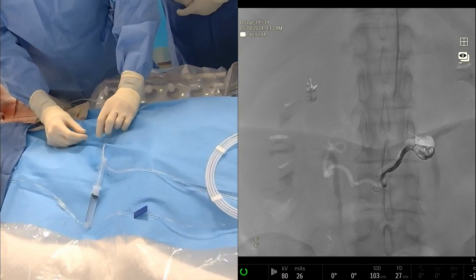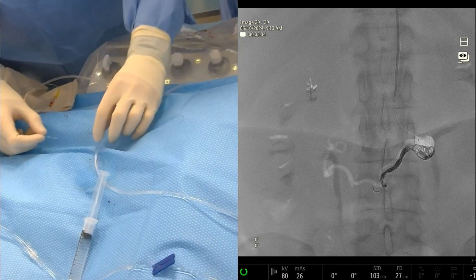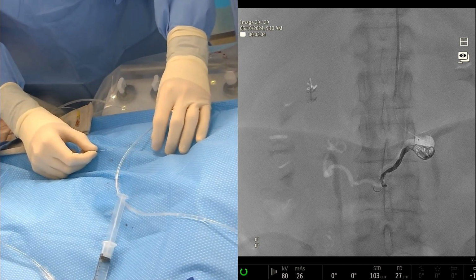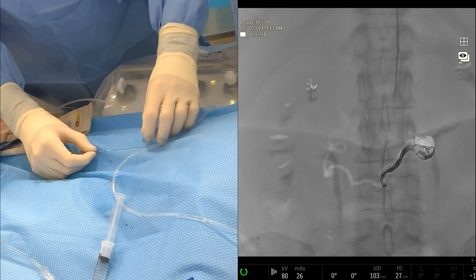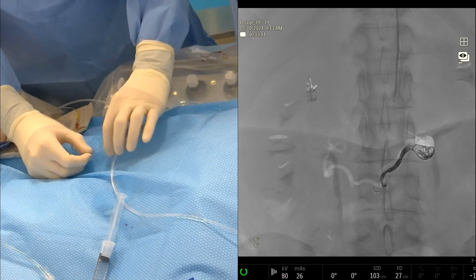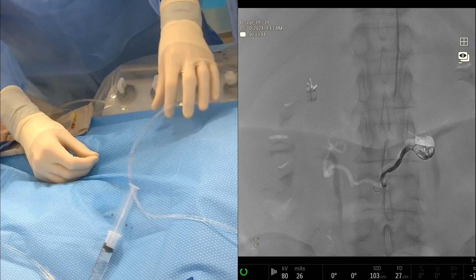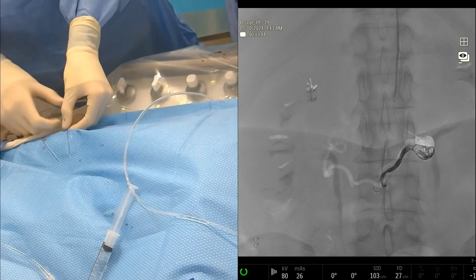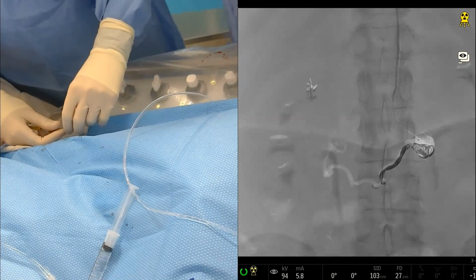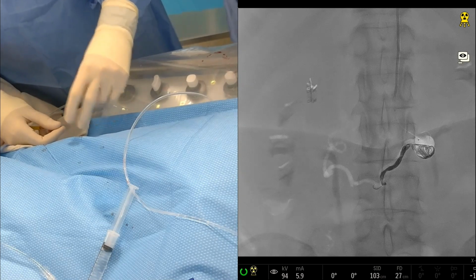Okay, so we can see the two white lines here on the back of the coil. That's just where you can break the coil, and it's just a string through the inside that's going to detach it. So it's a very easy mechanism. Just break and pull. You don't have to pull the whole thing out. And it's just the tiniest bit to release it. And then you'll see as we come back, that's our end, and the coil stays behind.